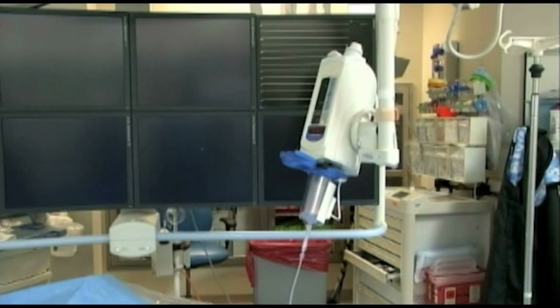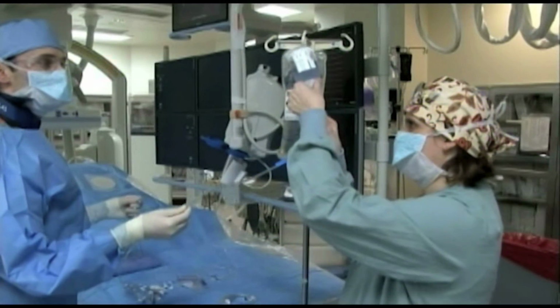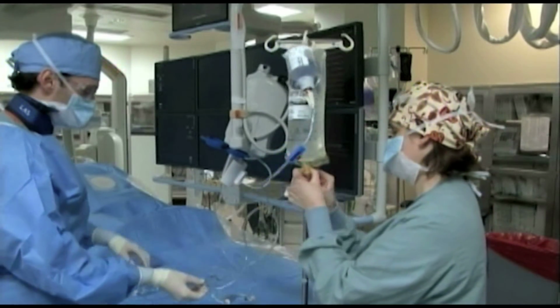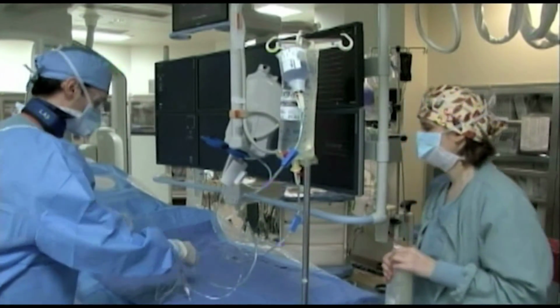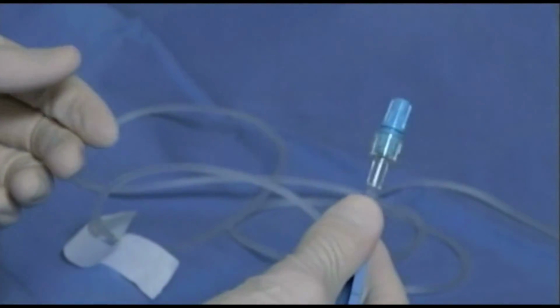A contrast injector and multiple pressurized heparin saline bags are prepared. Endovascular equipment is placed at the foot of the table, and a second table is moved in place behind the endovascular surgeon for equipment preparation and overflow capacity. The lines are meticulously cleared of any bubbles.